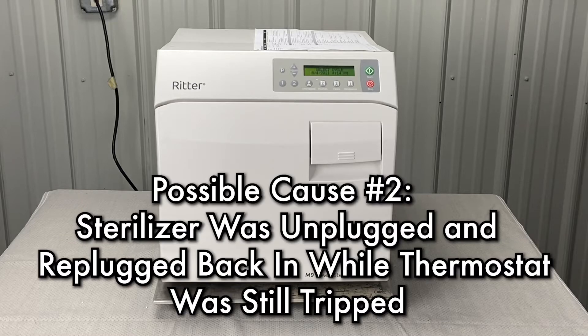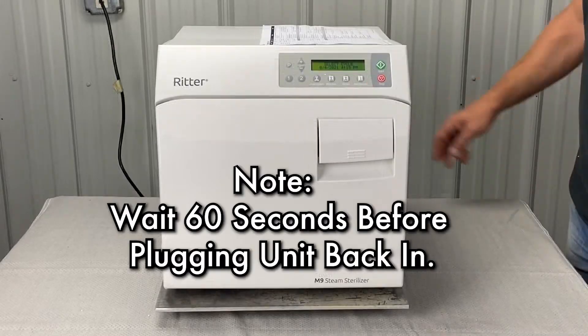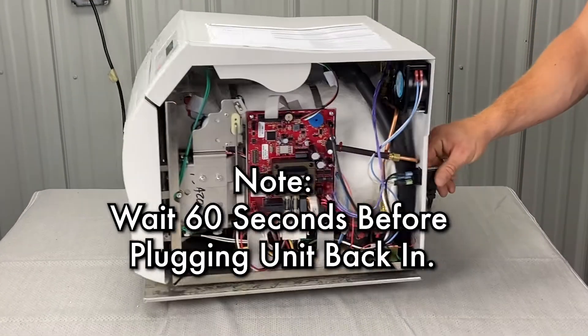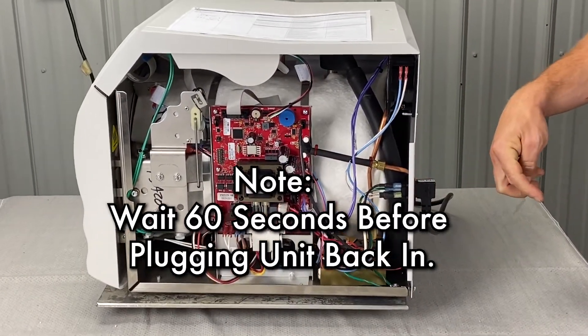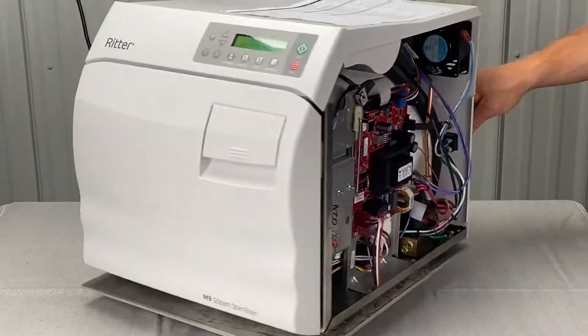The next thing: the sterilizer may have been unplugged and plugged back in while the thermostat was still tripped. If you have an error and need to reset it, unplug the unit, wait 60 seconds, then replug it back in — that will erase the last error code.